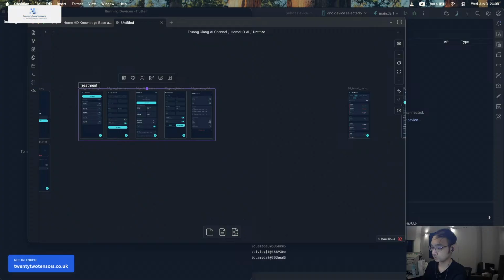And it also needs to be able to input the blood test and analyze the screen. I don't have a screenshot of the analysis here, so this tool will be removed because it's not needed, not one of the functions.